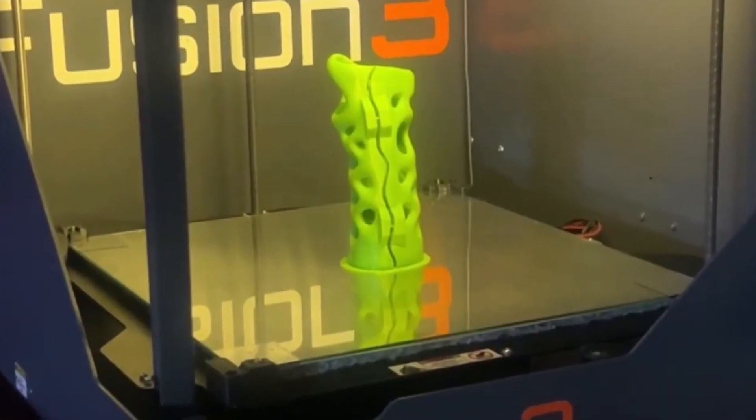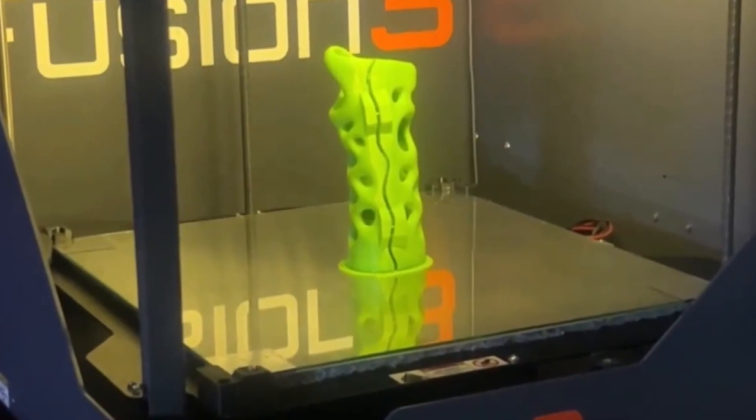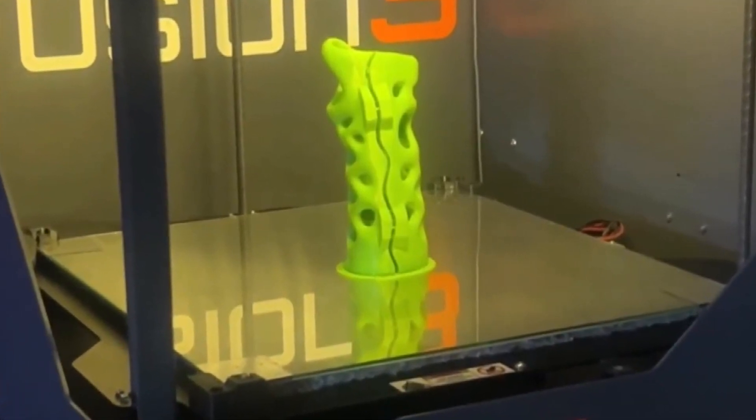The traditional cast was horrible — every time she needed to itch, she couldn't, and it smelled really bad. But now, Serenity is the first in Louisiana to get a 3D printed cast.